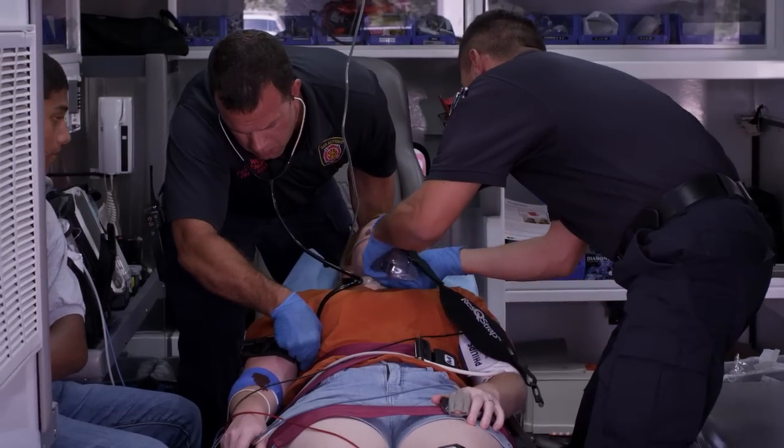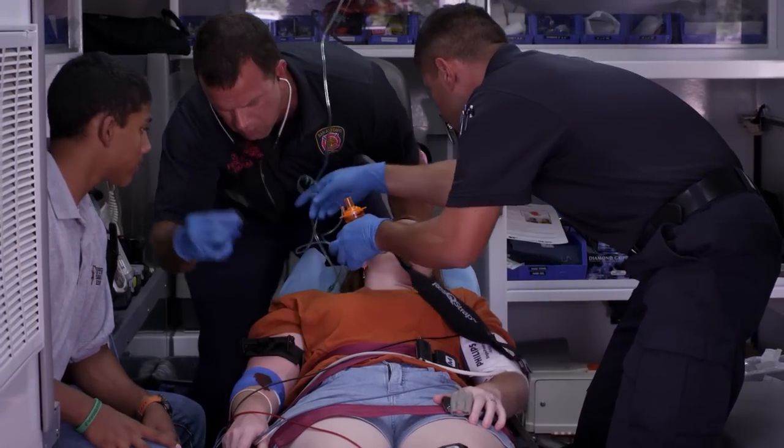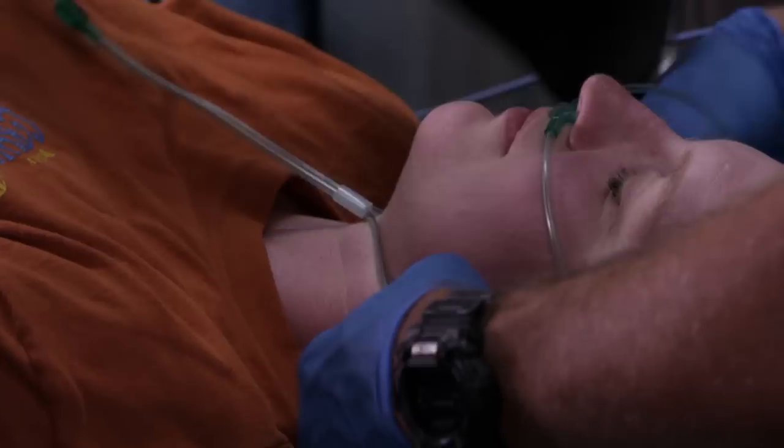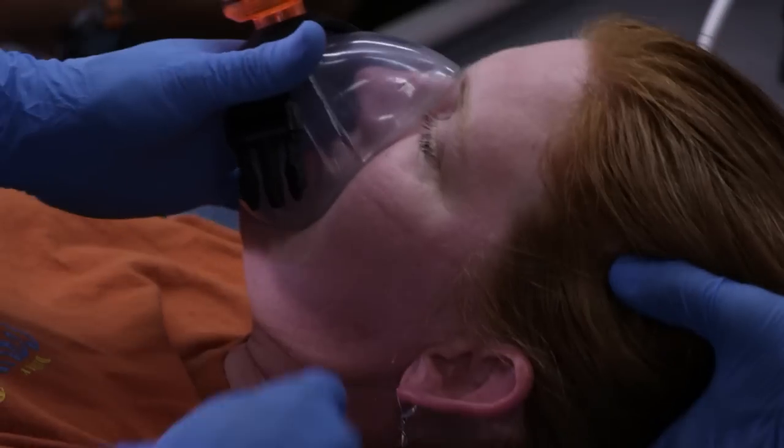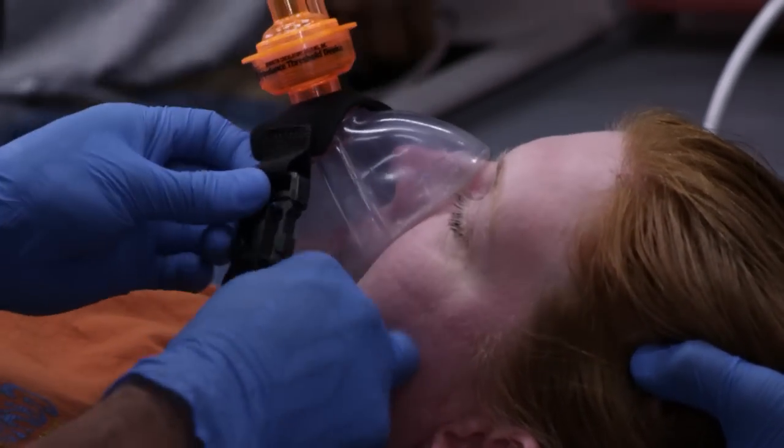Okay, I'm going to take this cannula off you, okay? We're going to put this mask on you. It's going to feel a little uncomfortable at first, but it's going to help you, okay? It's going to help us bring your blood pressure back up. Lung sounds are clear. Lung sounds are clear. Just bring your blood pressure up.